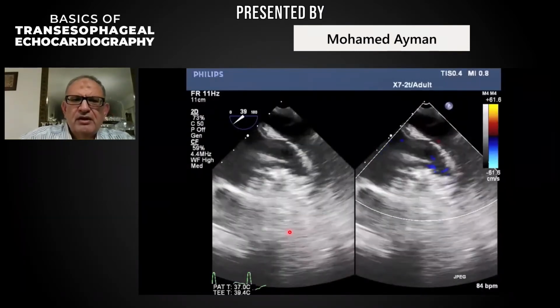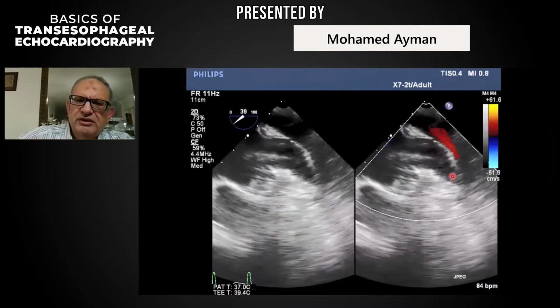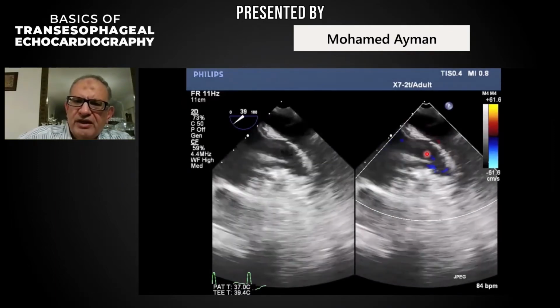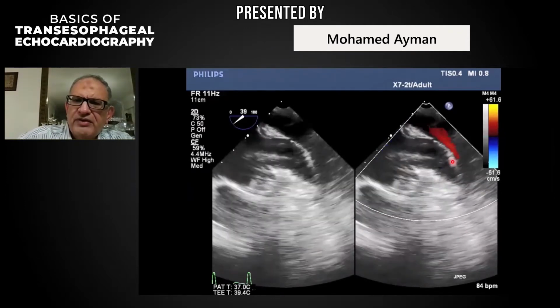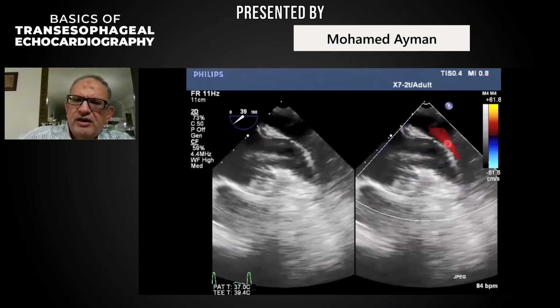This is the left atrial appendage, as you can see here. And this is the Coumadin ridge, or what we call the warfarin ridge. This is a very important landmark which is present here, roofing the left atrial appendage. Behind it, above this warfarin ridge, you can see this very pretty red flow here.